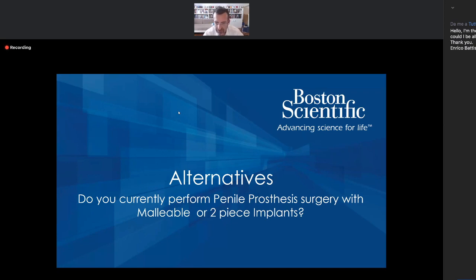I think it's a good device. I mean, you obviously need higher corporotomies, and probably it's not as comfortable a device as the three-piece, but I think it's a very good device in my opinion. I have used it definitely, and I keep on doing it when I have the opportunity.